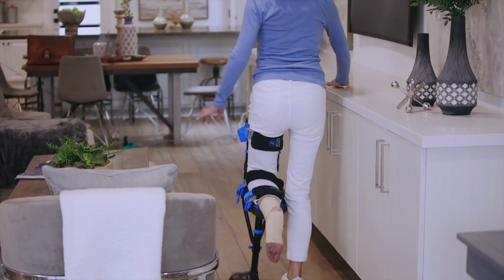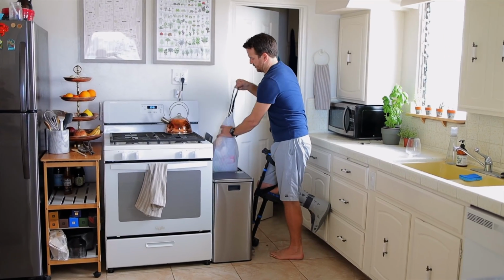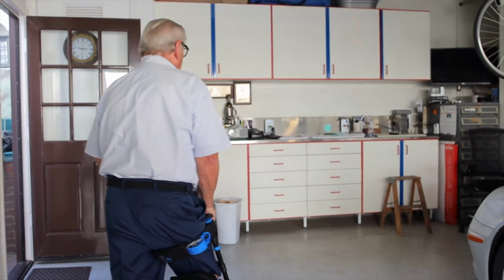The patient should have comfortable shoes with flat soles. Avoid open toes or open heels. Learning with bare feet is okay and often preferable to wearing shoes. Be patient and supportive. Some people adapt in minutes, others take longer.